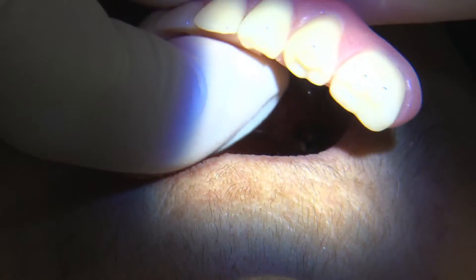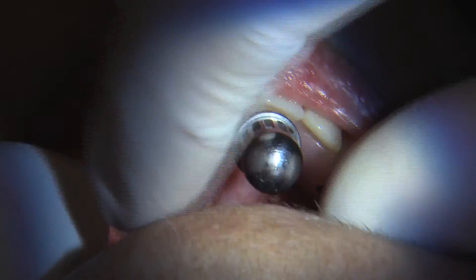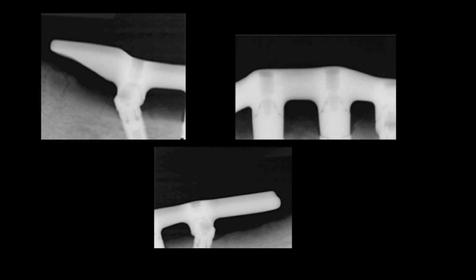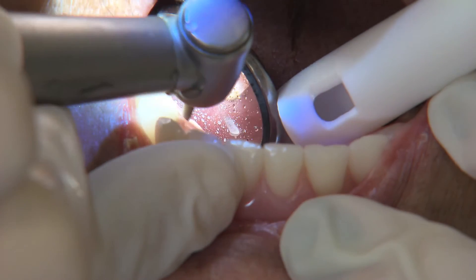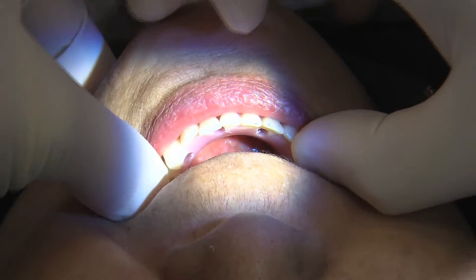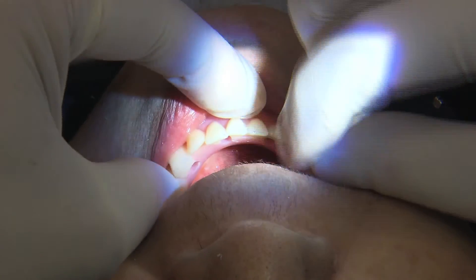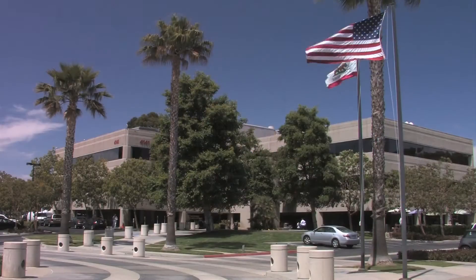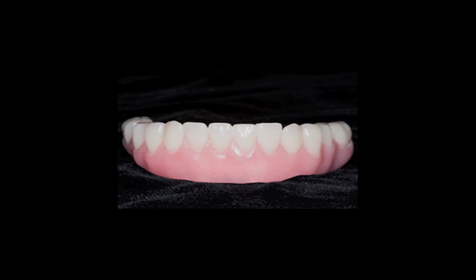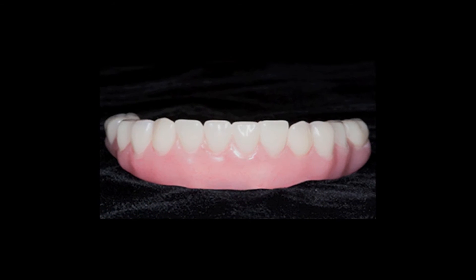After removing the printed denture model from the mold, denture teeth were inserted and affixed to the milled bar with wax, and an appointment was made for try-in. After removing the provisional prosthesis, the denture setup was placed with one screw tightened on the milled bar and radiographs were taken to verify passive fit of the substructure. A small adjustment was made, and the verified denture setup was sent back to the lab.